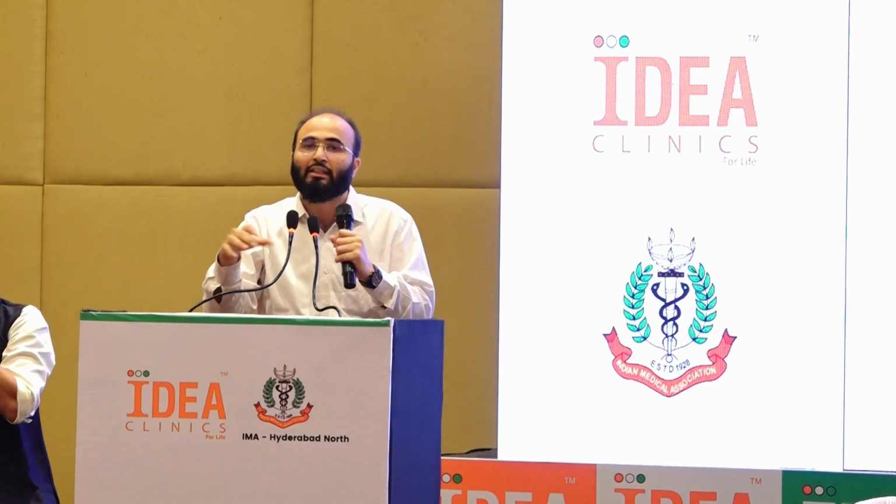So small doses, 0.5 unit, 0.3 unit, 1 unit, it gives auto corrections and tries to bring the sugar down. Therefore the glycemic variability reduces, the time in range improves, the risk of hypoglycemia is lower, and overall the outcomes are also better. Thank you. So any further questions on the insulin pump?